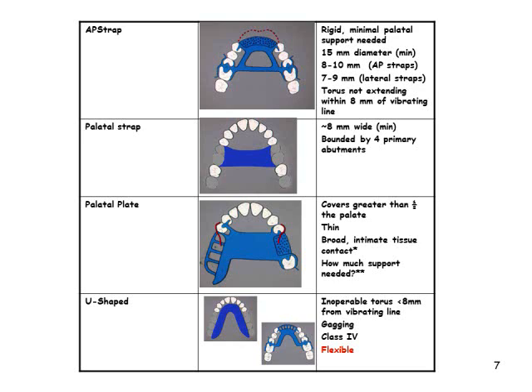The complete palatal coverage major connector has an anatomic replica form for full palatal metal casting supported in the anterior rest seats. It is designed for the attachment of acrylic resin extension bases. It contacts all, or almost all, the teeth remaining in the arch. The posterior border terminates at, or anterior to, the vibrating line, and extends to the hamular notch area, on the distal extension side. It crosses the palate, at right angles to the midline.